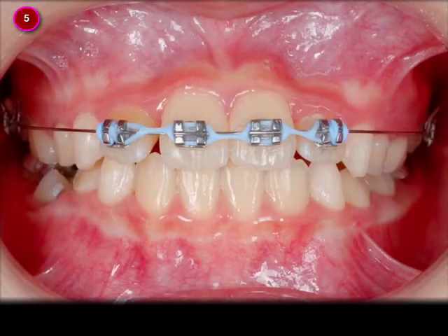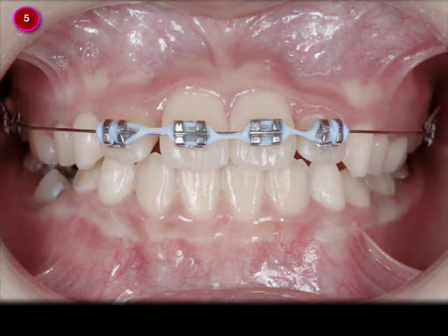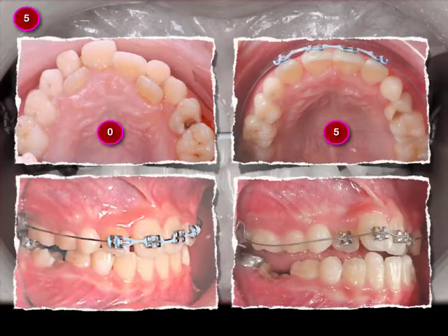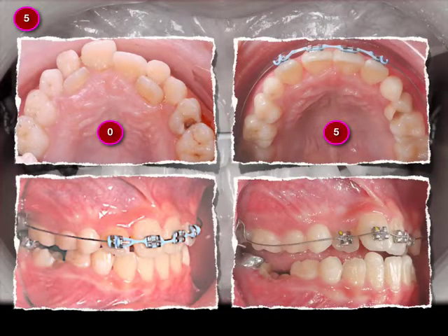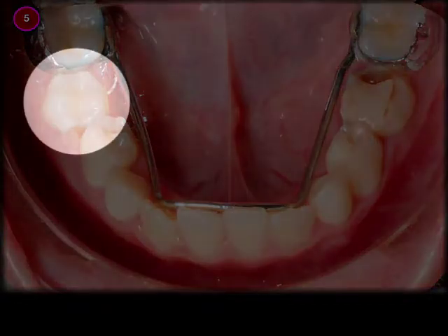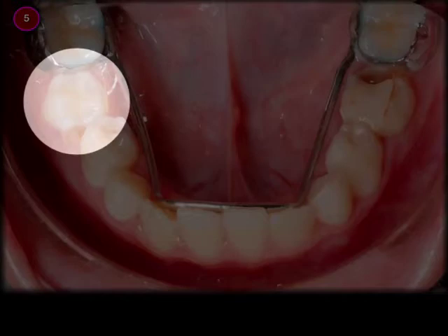Five months later the crossbite had been corrected. You can also see that in the occlusal views and lateral views. At the same time the lower second premolar erupted, so we removed the lingual arch.